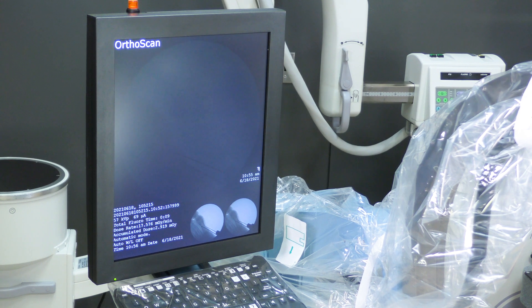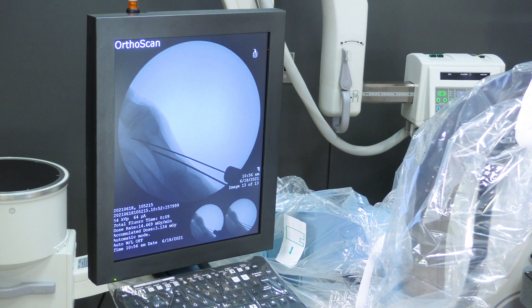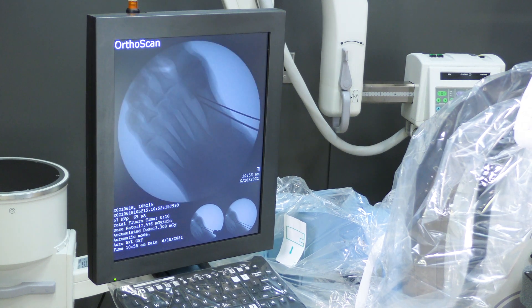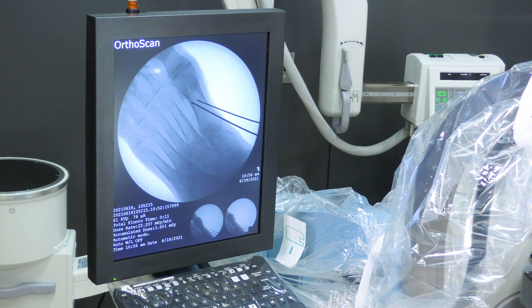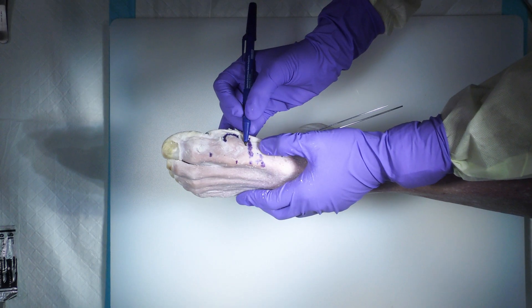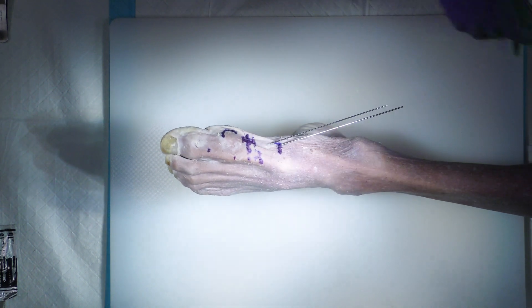I'll take an x-ray — perfect. I'll come back and make sure I'm clear of my osteotomy site. Then I'm ready for my osteotomy. I plan my incision and it's literally just going to be the width of the saw.